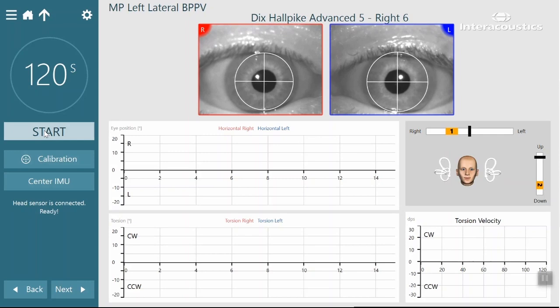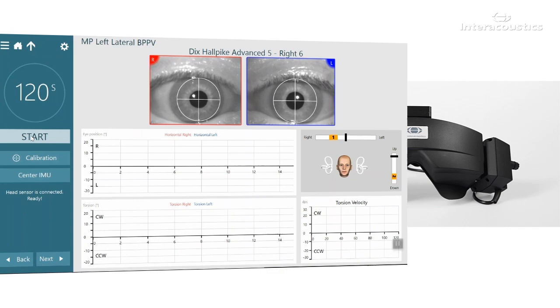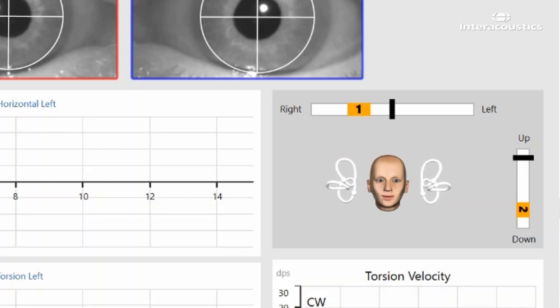The 3D head model will then represent the patient's head position as soon as the sensor has been calibrated. There is a target graph above the head model with an indicator to allow the examiner to see when they have placed the patient's head to precisely 45 degrees left or right.